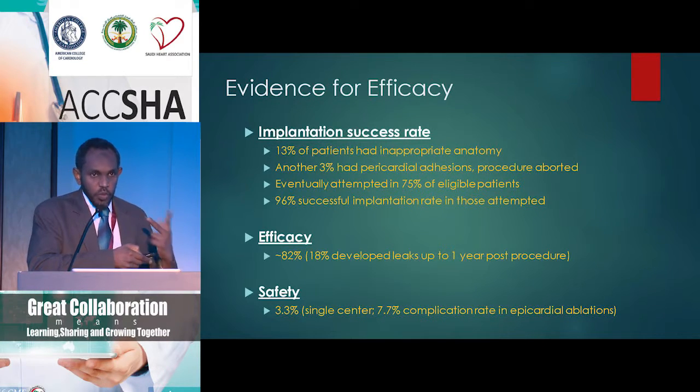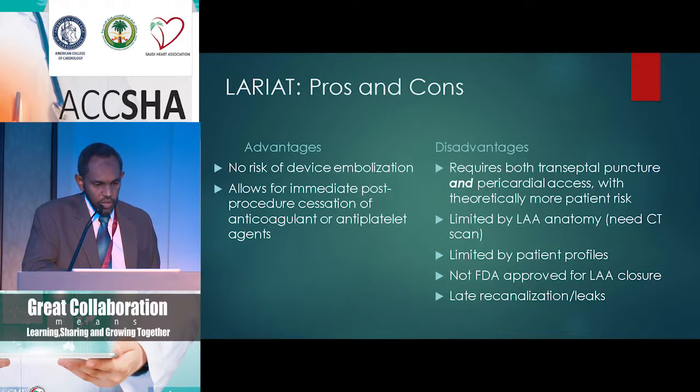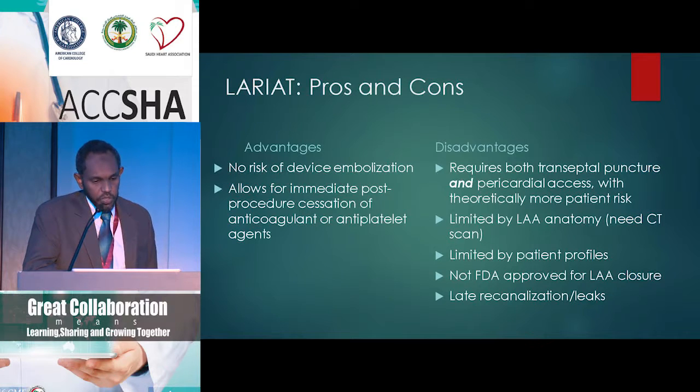Generally speaking, it involves 2 accesses and 2 sets of complications with these accesses, so it's not going to be less than the other devices. Pros and cons: there's no risk of device embolization compared to the other 2 devices. It allows for immediate post-procedure cessation of anticoagulation or antiplatelet agents. So after the procedure is done, you can actually reverse the heparin and be done with this anticoagulation business.